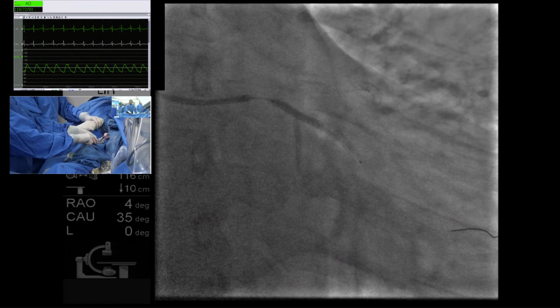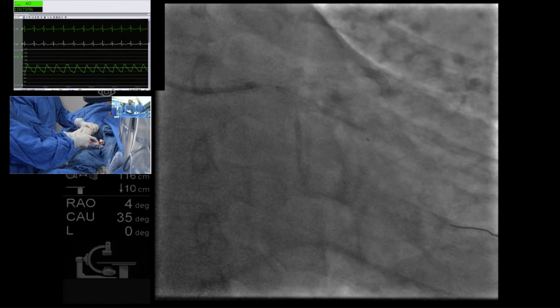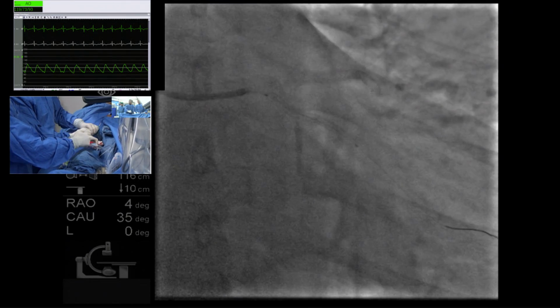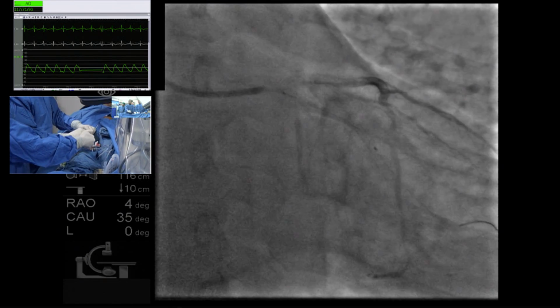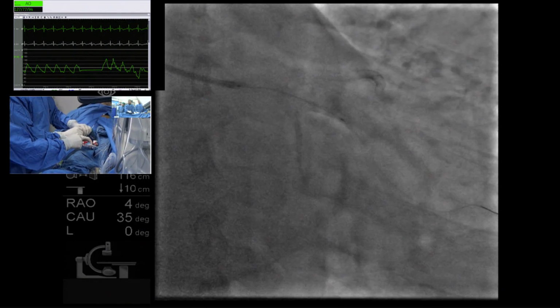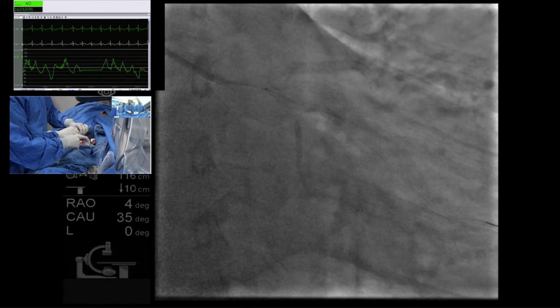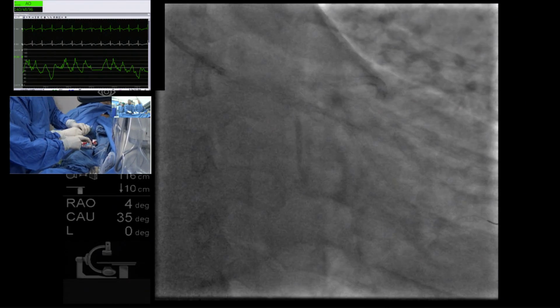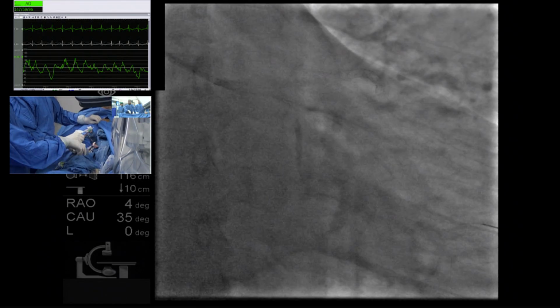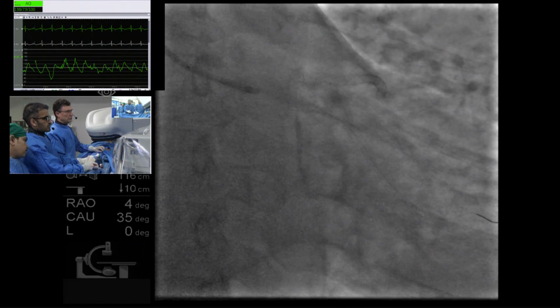This is going to look pretty. Let me just do a quick puff, quick puff. And actually it looks a little bit, oh shit. So here we have, look at how this happens when you do left radial, the catheter tends to dive in a little bit more. So we're having very, very close control of the guiding catheter.